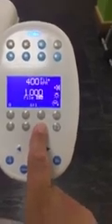So the first thing that I can adjust here is the scale at which we're measuring torque. So we can have gram centimetres of torque or Newton centimetres of torque. Most file systems seem to be measuring in Newton centimetres of torque, so I'm going to leave that there as it is. And then we can actually adjust this torque setting.